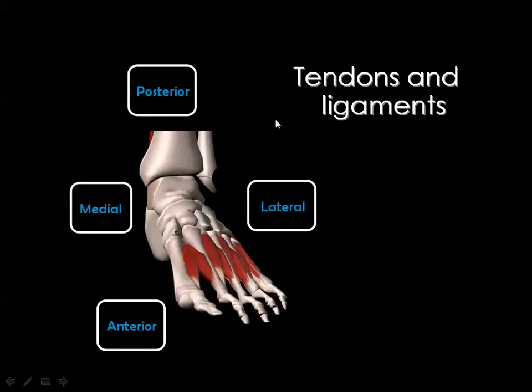And in every part of these four directions, we should look for tendons and ligaments. And after finishing these two main issues, then we'll have a few other points in the ankle. Then we can finish the whole story.